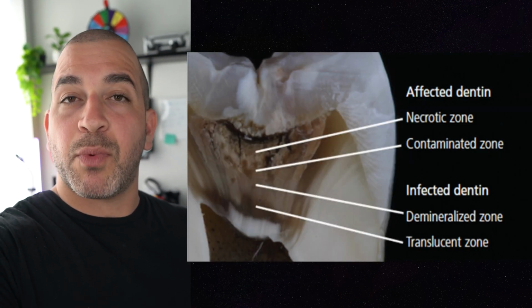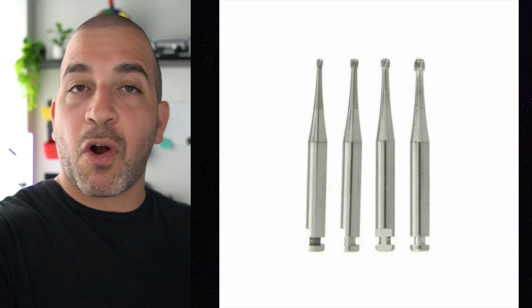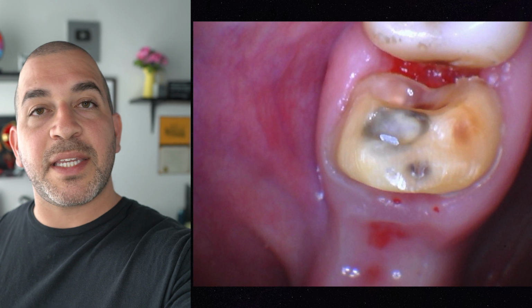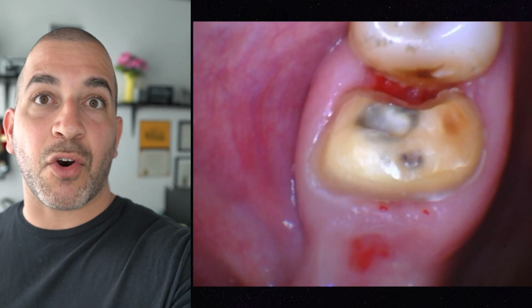When dentists are cleaning out decay, we have to be pretty careful and pretty precise with how we remove that carious tooth structure. By starting at essentially the perimeter of the decay and working our way towards the middle, and using a sequence of large round burrs that run at a slow speed, we're able to carefully remove the decay little by little. Now in this case, after removing the cavity carefully, we did reach a hard stopping point, which was very close to where the nerve lies.